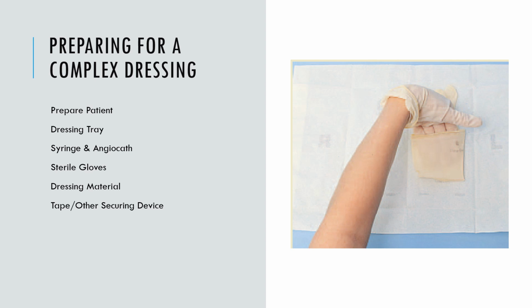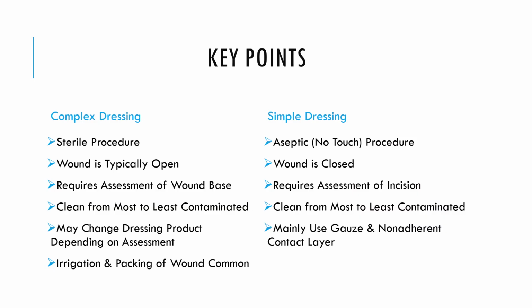I'm not going to talk about how to do a dressing because it is very similar to your simple wound dressings. It's just that you will use a sterile technique instead of a clean or aseptic technique in complex wounds. There are some key differences between the complex dressing and the simple dressing.